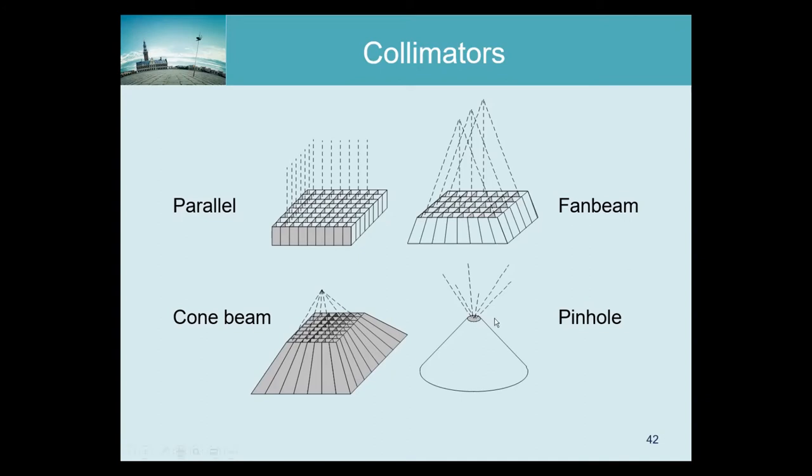I think in principle, it is definitely possible to do pinhole SPECT and to reconstruct from it. In clinical imaging, that's never done. I'm not exactly sure why. I think partly for historic reasons, because pinhole reconstruction is more difficult. I think also to some extent for safety reasons, you don't want to be hit by a pinhole collimator, but I guess that could be avoided.